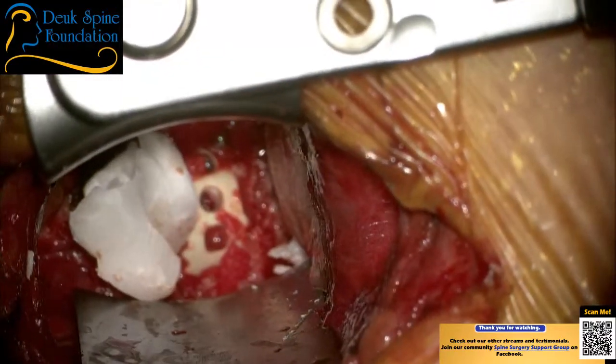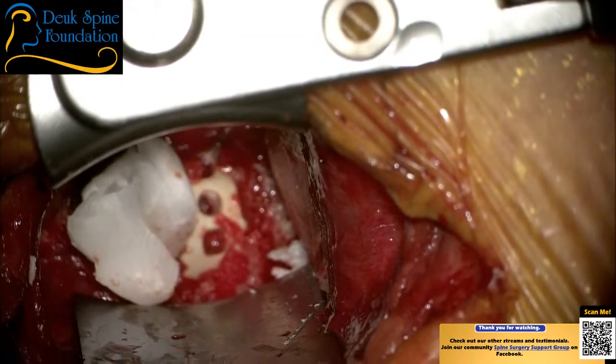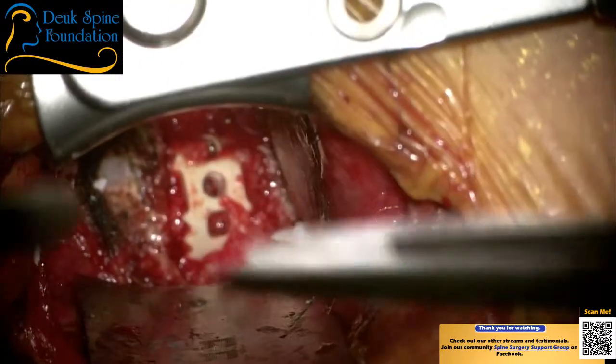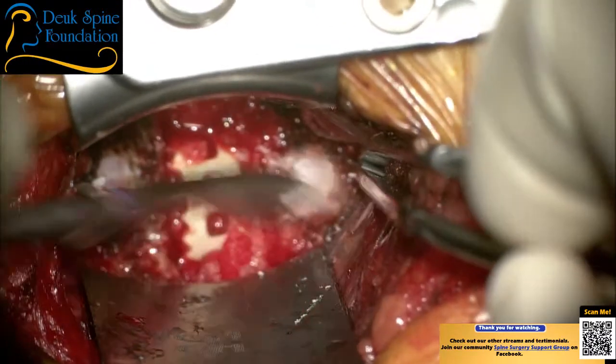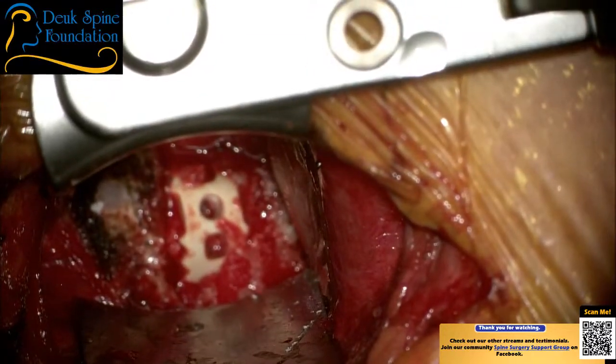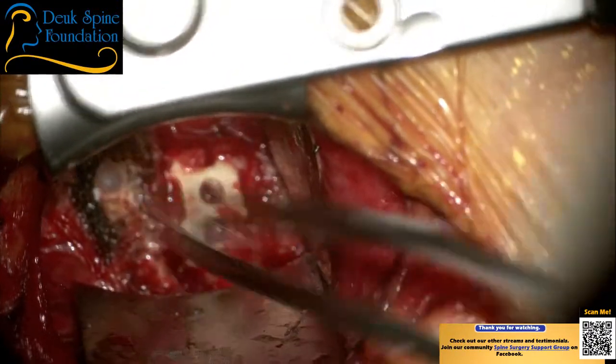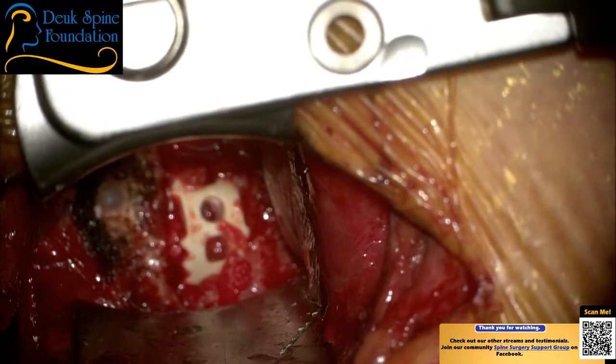All right, we need a pickup. So we're going to take this extra bone wax out. And I'm going to look over here, and I see a little piece there. Get that out. I'm going to check the hole. The hole's not bleeding. It's perfect. Check this hole. It's not bleeding. We are ready for the plate.